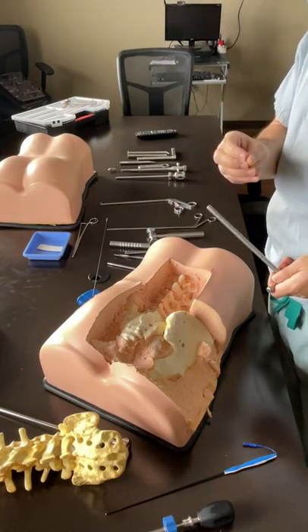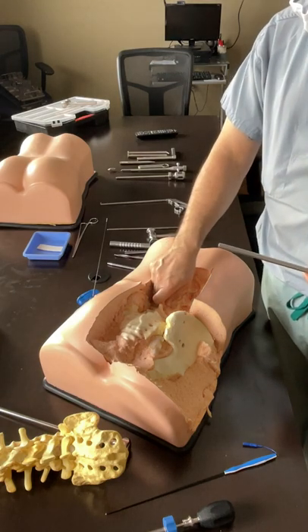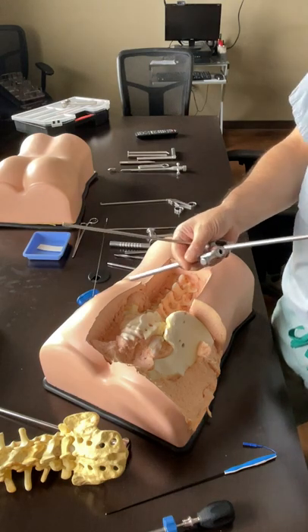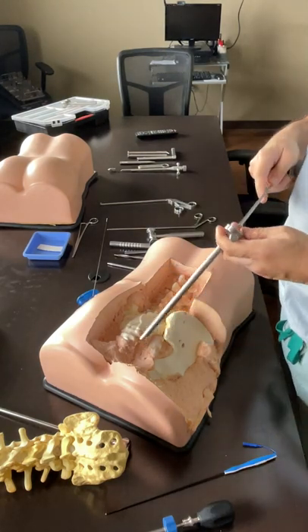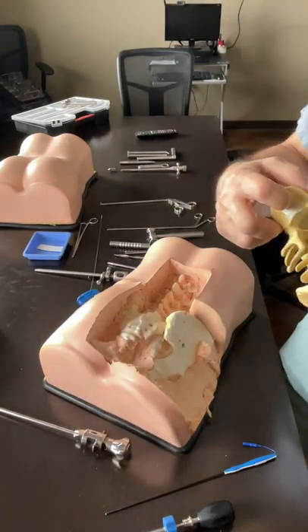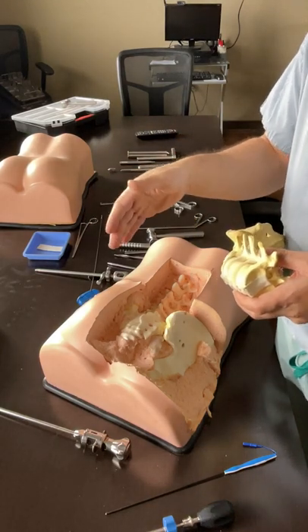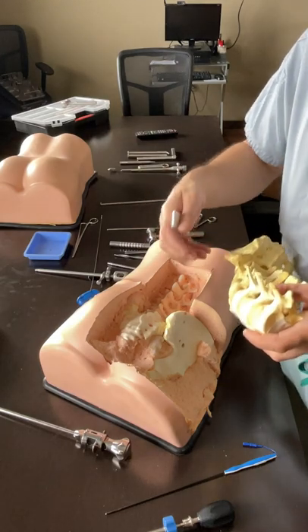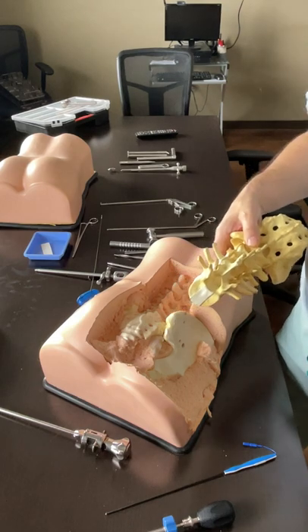Sometimes truly big chunks come out. Once I'm comfortable with end plate preparation and discectomy by feeling, I use tricalcium phosphate soaked with bone marrow. This is directional - you can direct it whatever direction you want. Another perk: I often on purpose try to break a little through the end plate - you can do that with the rake or with the pituitary. I literally penetrate the end plate; it can bleed, but you pack it with tricalcium phosphate and it stops right away. I create a true highway from one bone to another - that is partially why our fusion rate is 98%.